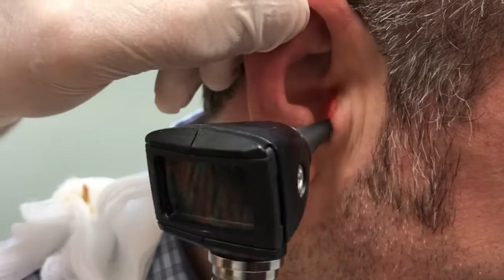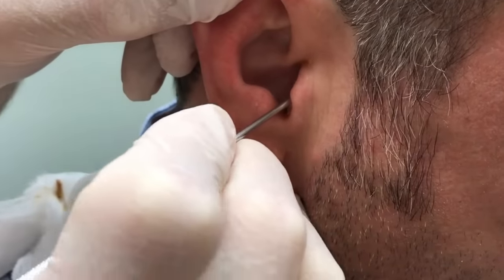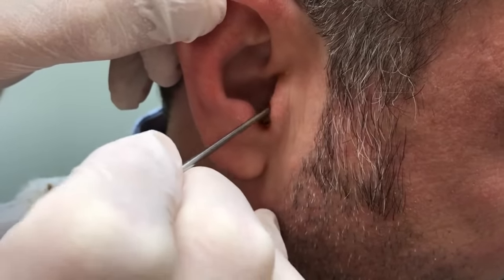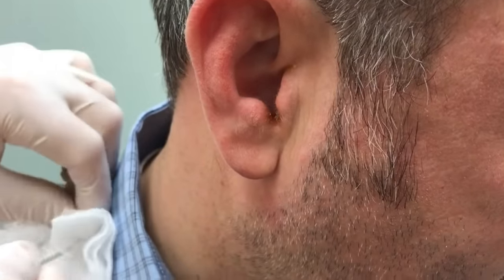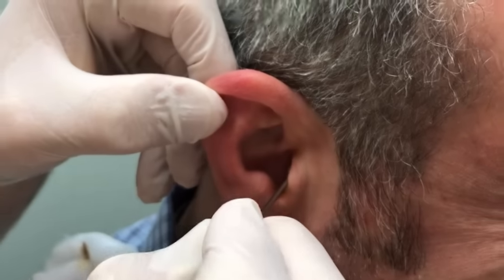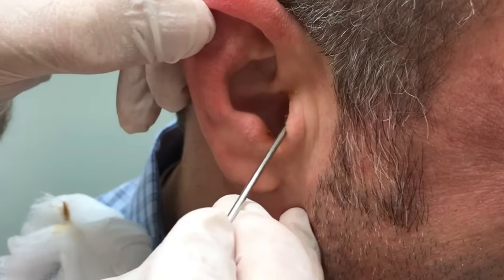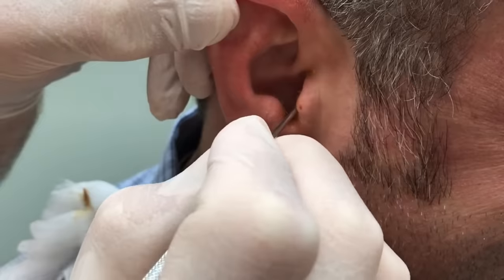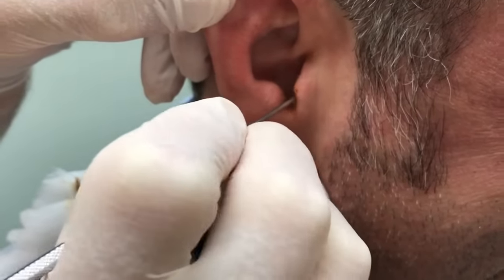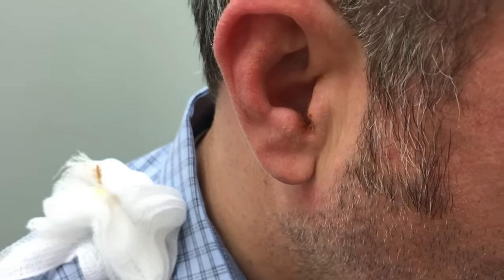Let's get another look in there. I bet you can hear me now, can't you? A little bit better. What we generally recommend for people that have a problem with cerumen building up in the ears — there are some over-the-counter kits that have a little ear wax softener product in them. You can use that to soften the wax, and it has a bulb syringe that you can use to rinse the wax out.